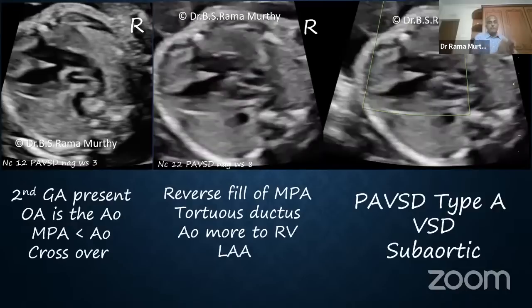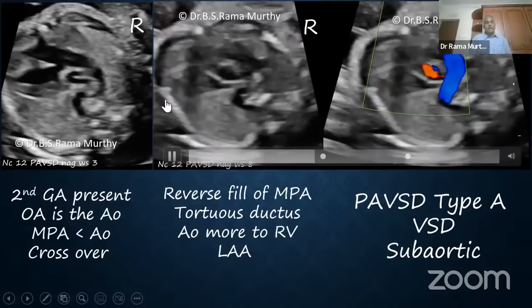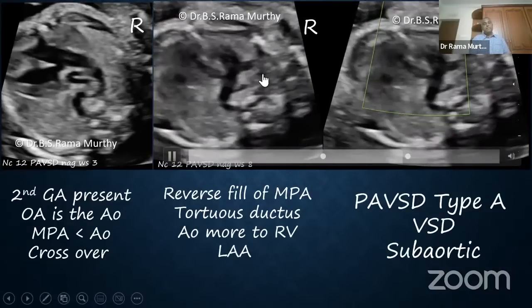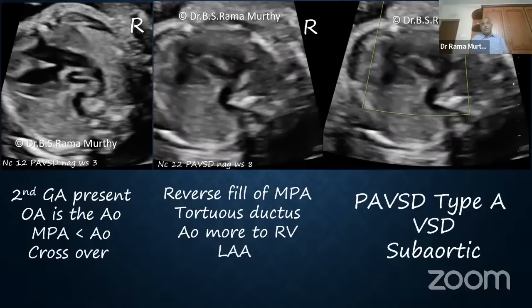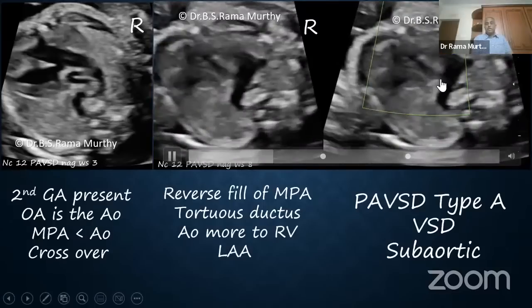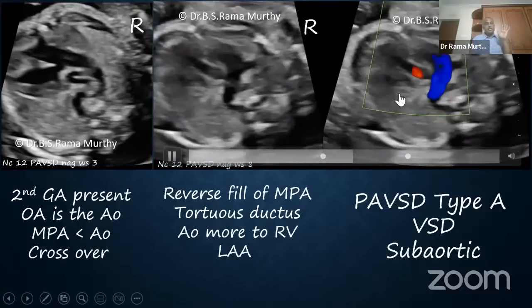We said that the pulmonary artery is narrow. We also said that the great arterial crisscross is there. That is the aorta. That is the pulmonary artery. Crisscross is there, or everything trying to fit into TOF. But when I turn the color Doppler on, you find the reverse flow, and that opens my eyes. Oh, it is not TOF, it's a PAVSD.